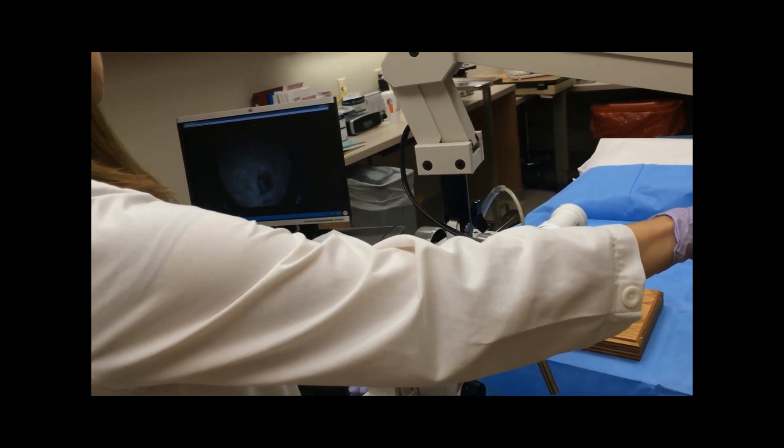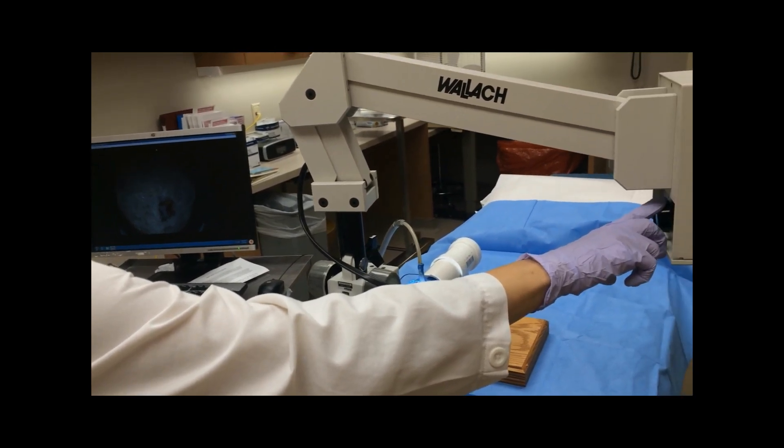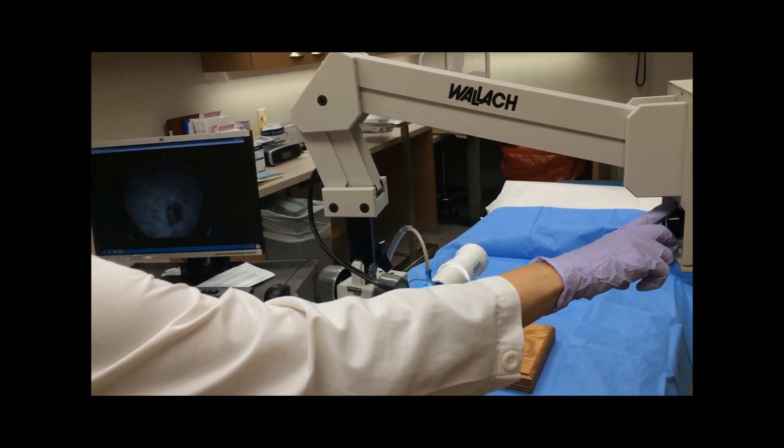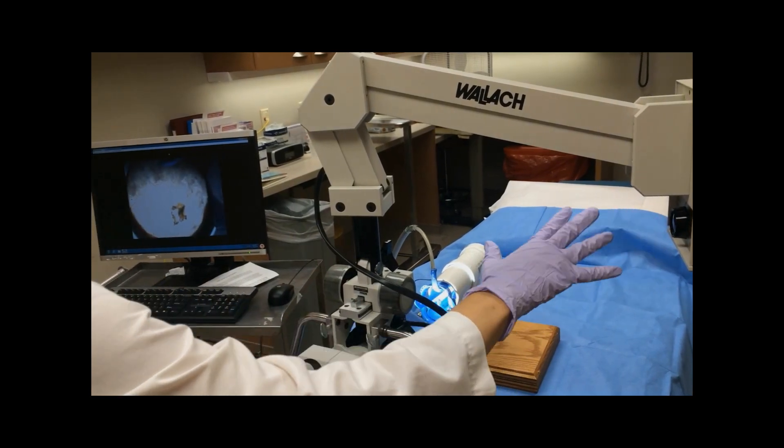Sometimes there will be a glare because of the lighting, and you have to turn down the light in order to see it on the TV screen. Through the actual scope, that doesn't tend to bother you, and you can leave it at the highest level of light.